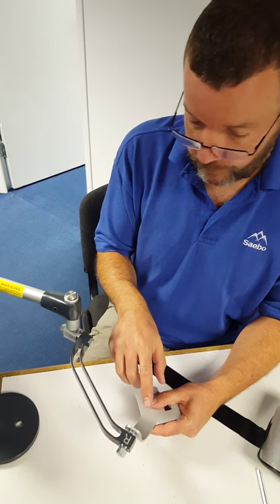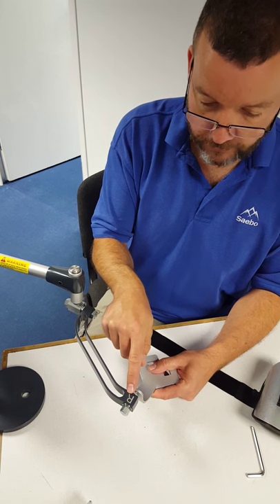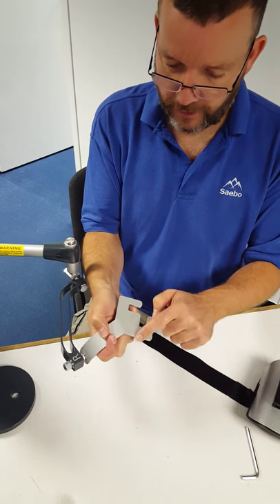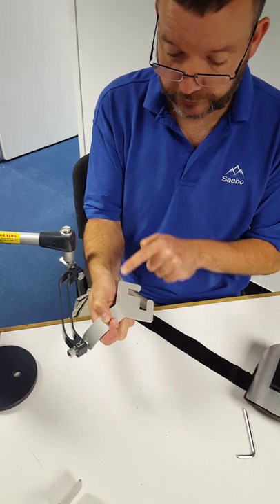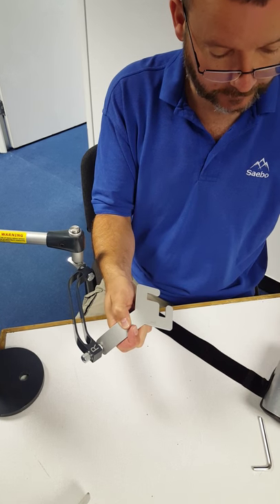Setting up the pronation supination system for the right hand side. We have the right facing upwards; come underneath we have left and right. We're going to slot the forearm shell into the part which says R4 right.